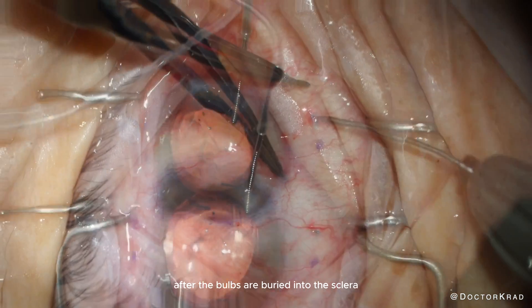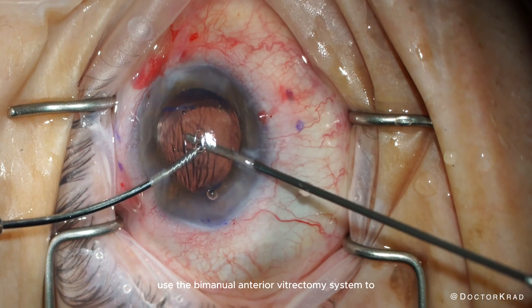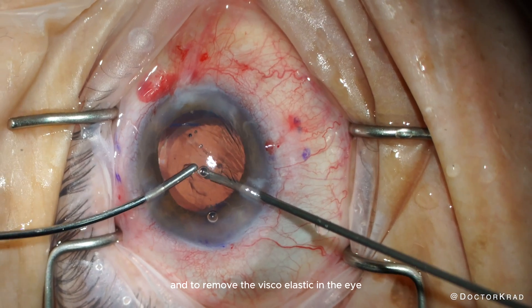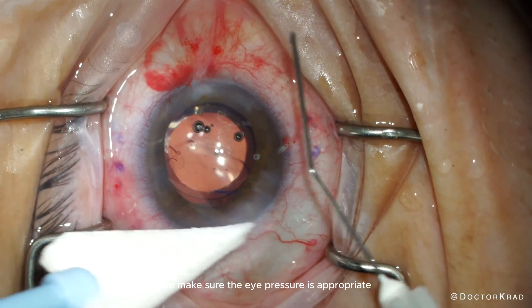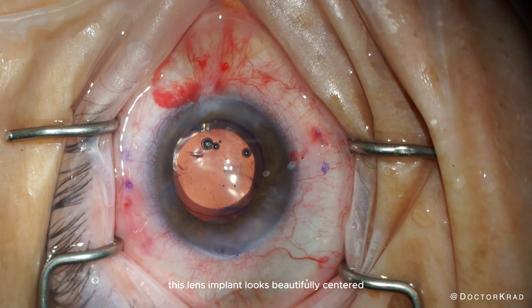Next, we bury these haptics into the sclera. After the bulbs are buried, we remove the AC maintainer and use the bimanual anterior vitrectomy system to ensure there's no vitreous and to remove the viscoelastic. Then we seal the incisions, confirm appropriate eye pressure, and verify all incisions are watertight.